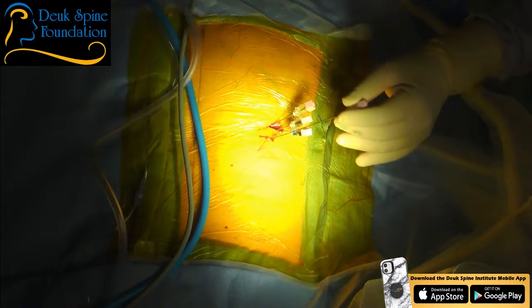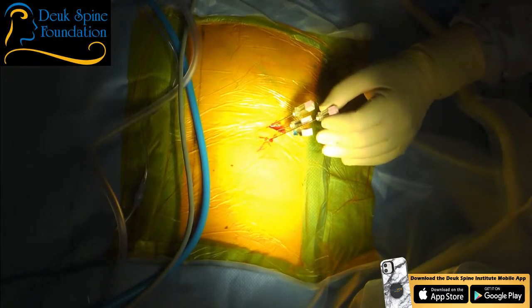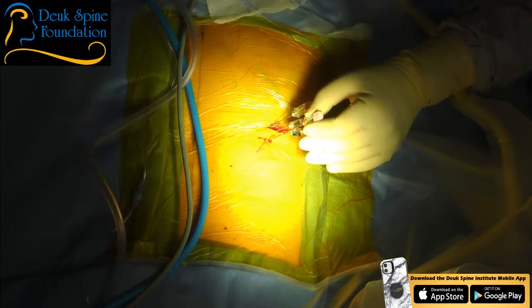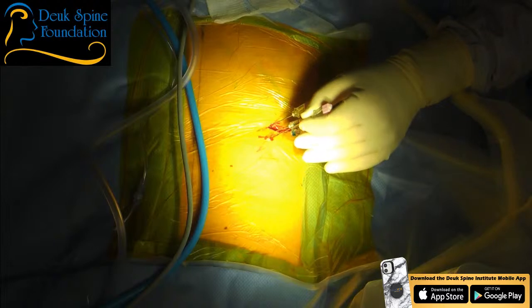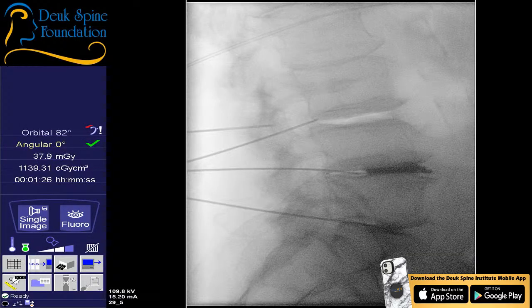3-4 is tough. Shot. So I want to contact the facet, which I'm doing now. Shot. And I want to slip around it. Shot. No. Shot. I'm still on it. Shot. Where? I can't. All right. That's your facet.